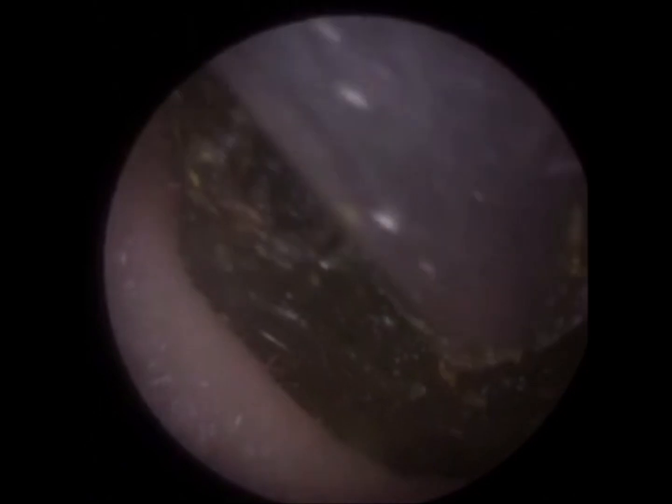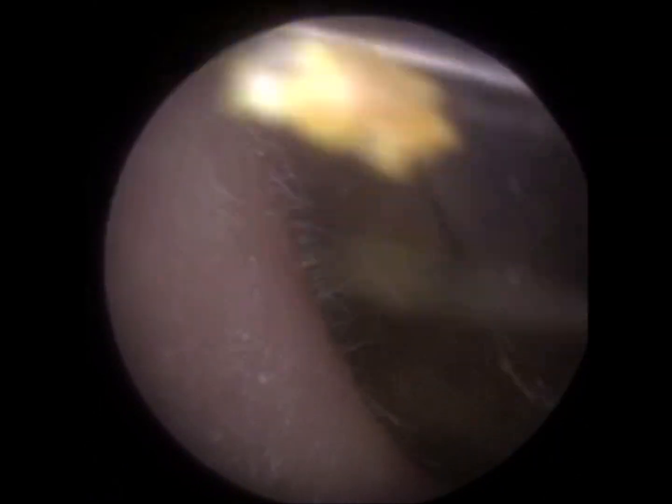So in this particular procedure, I'm just trying to get a suction grip. You may have seen before, I was lifting the wax off the posterior canal wall. It's important when you do get a suction grip, you don't want to press too hard with the Zollner suction probe because it can quite easily get blocked. It's a lot of touch and feel, kinesthetic feel, and you just want to get enough suction grip onto the wax and then delicately wriggle in concentric circular motions, as I'm doing, to ease the wax out.